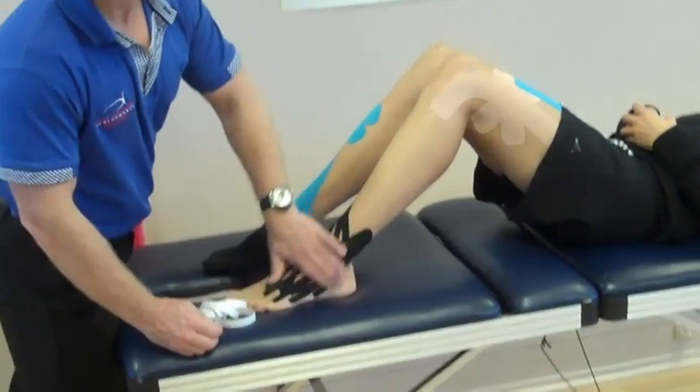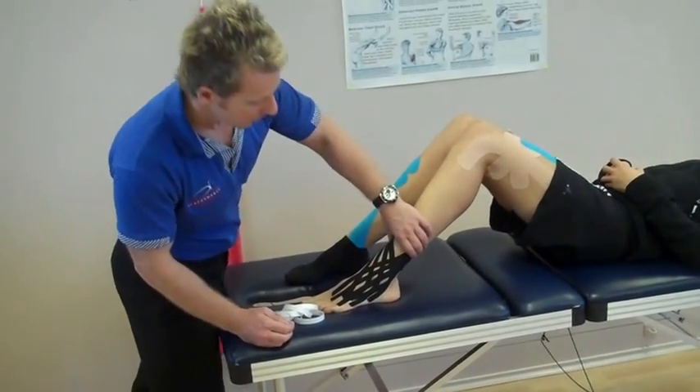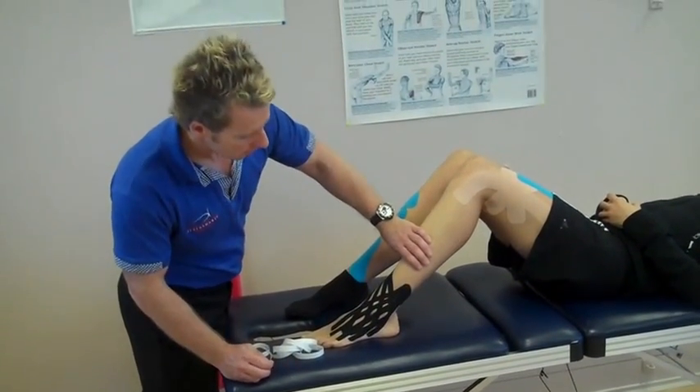And that is all you're taking for edema control for an ankle swelling.